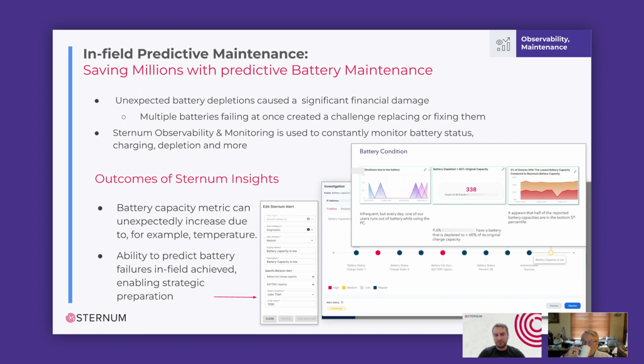You can also use metrics, like if you have any temperature sensor, to actually cross-check those metrics and compare it to the battery's depletion rate, right? So you can actually try to see if there is any unexpected environmental effect on the performance.